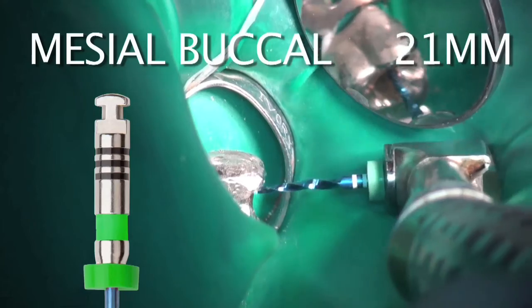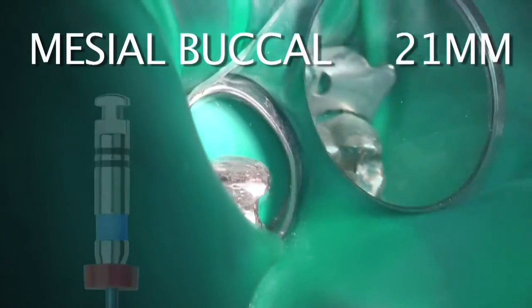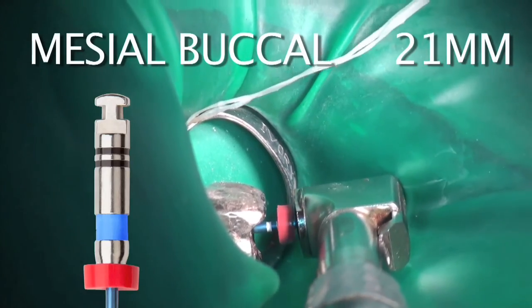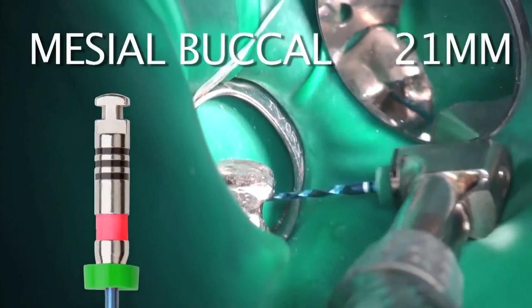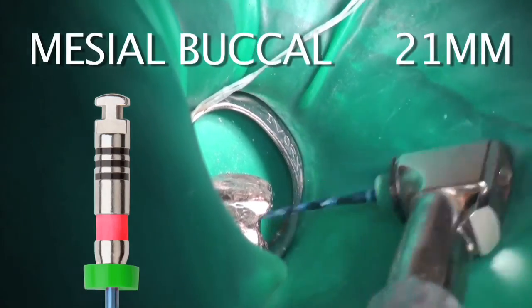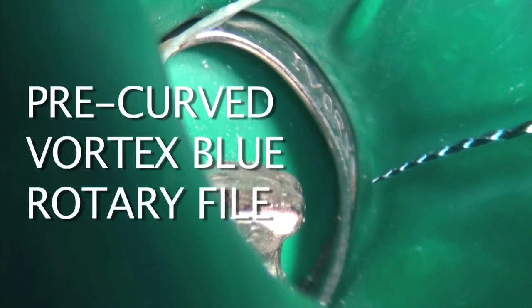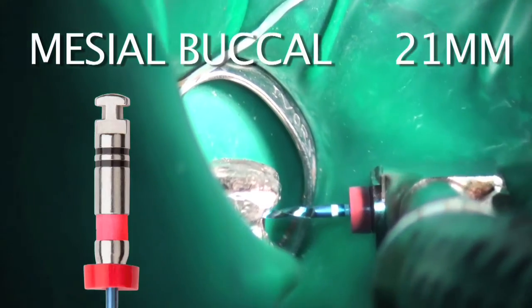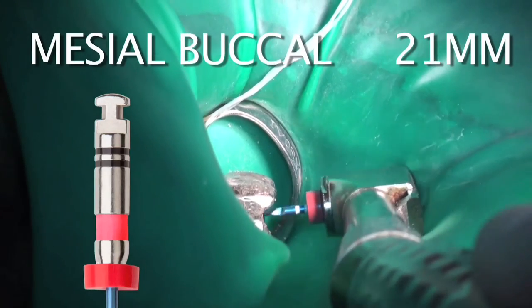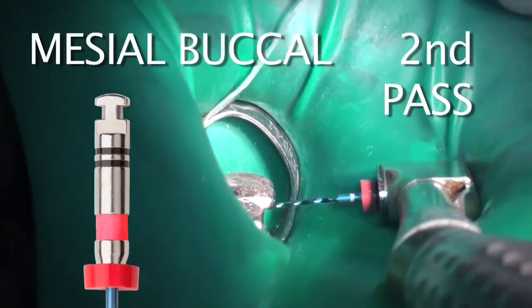Going to resistance with very light apical pressure. Videos can sometimes give the wrong impression of pressure through the microscope angle — this is actually a very light touch, just the weight of the contra angle and handpiece. Here I am at the 2506.2 working length. Now I'm going to pre-curve the Vortex Blue file — you can see the pre-curve for easier access. The file's not rotating yet — now I start it. And now this is the 2504 in the mesial buccal. I may have to go back and forth between the 2506 and 2504, making a second pass to achieve working length.